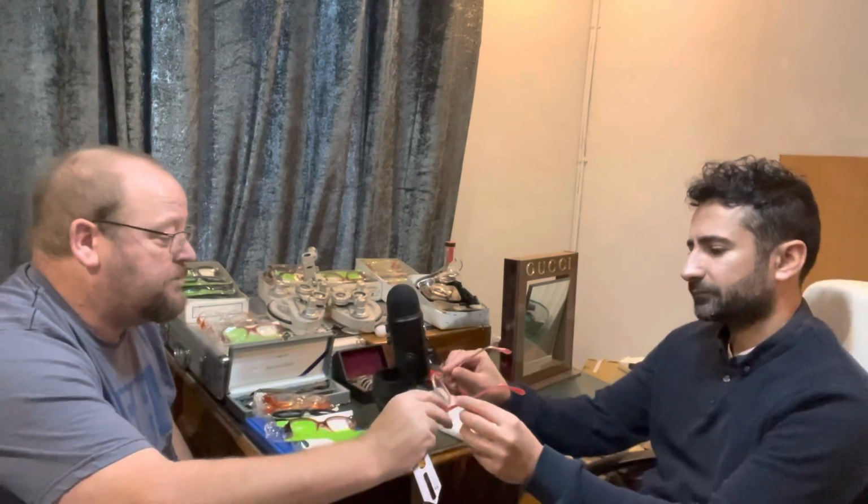This is one of the more fashionable sizes now, being a much larger frame. In fact, this particular frame in total width is 140 millimeters. The eye size is 54 millimeters and the bridge size is 18 millimeters. Now if you'd like to put that one on for me.